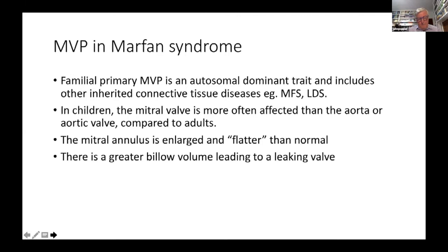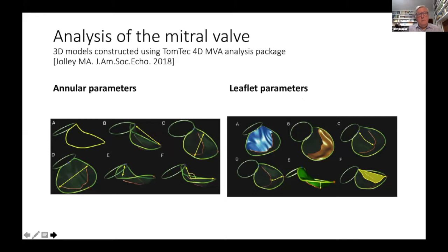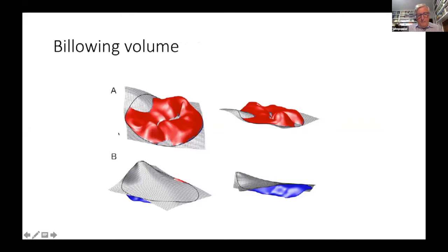Using TomTek 4D analysis, we now have fantastic technology to study the mitral valve. You can see the annulus, and here the leaflet parameters — this is the posterior leaflet, this is the anterior leaflet. This is a computer reconstruction showing the billowing volume that has come through the valve. This is abnormal; this is normal.